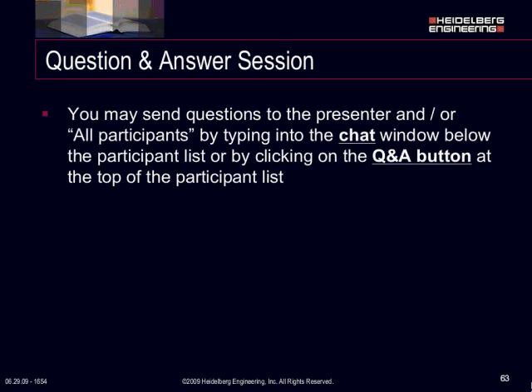Actually, I think the question has changed. It's actually, how do you get choroidal images better? If you're looking to image the choroid, you really want to get a good, nice high density image of the choroid. Yes, mirror the image itself. So push the joystick forward a little bit, flip the OCT or mirror the OCT, keep it in the upper third, and you'll be able to image the choroid better. That's excellent. That was actually our second question, so thank you so much for answering that.